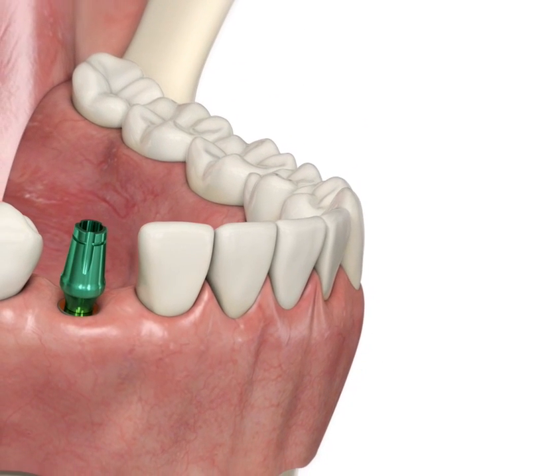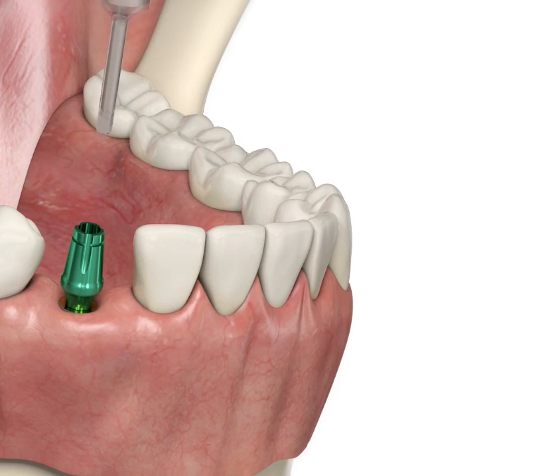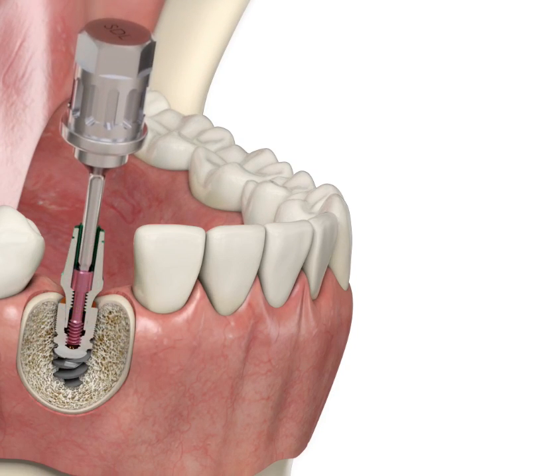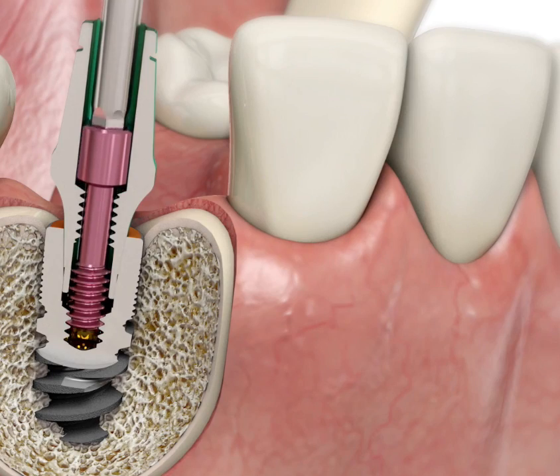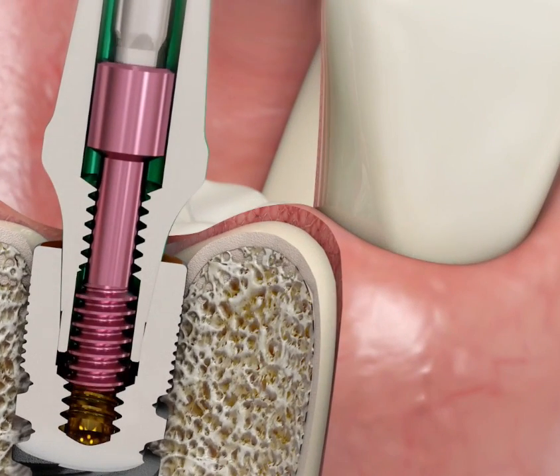A superstructure must be removed in the correct way. Place a screwdriver into the head of the fixing screw and unscrew in an anti-clockwise direction to remove the screw from the root implant thread.